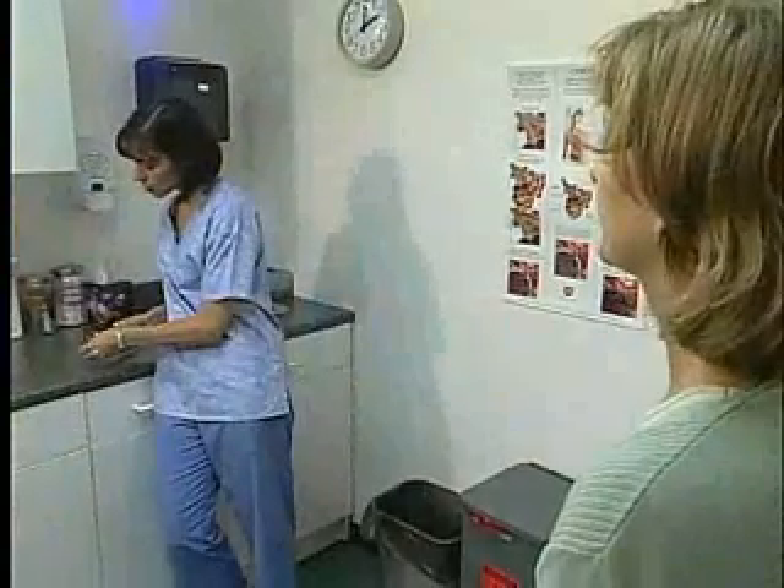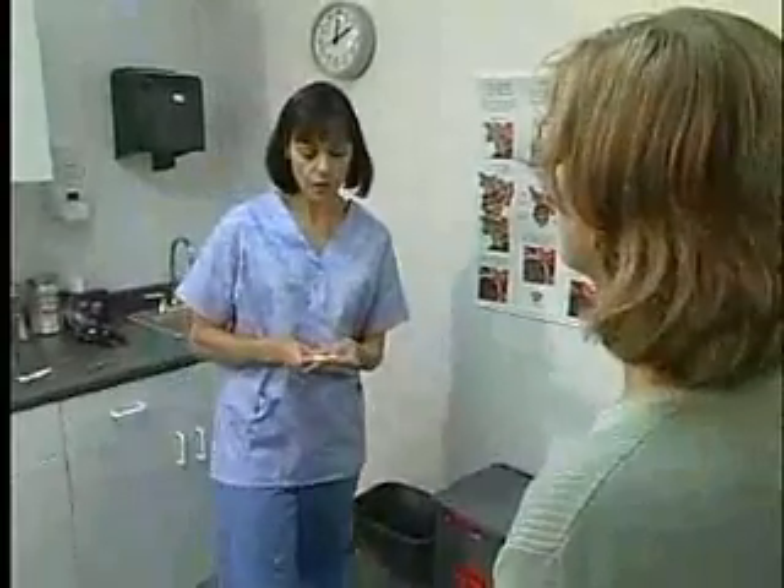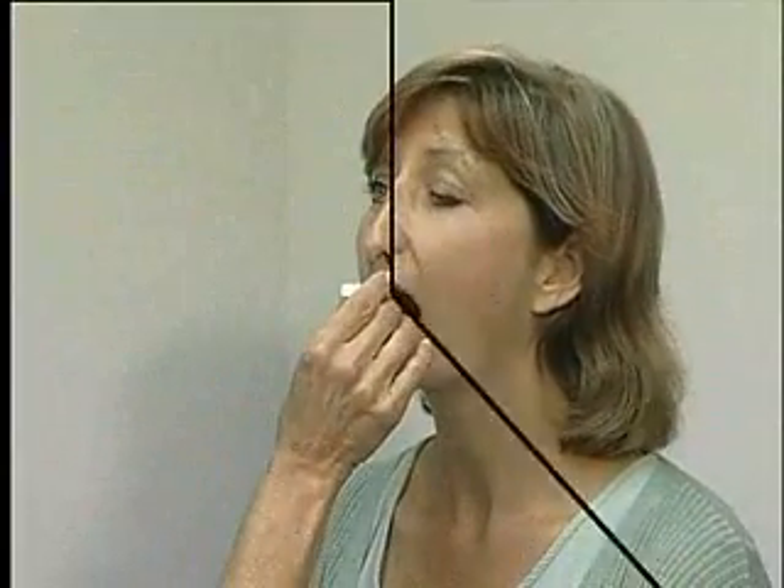I'm going to take your temperature. Do you smoke? No, why? Well, smoking can affect your temperature, and so can drinking fluids — but only if we were using an old-fashioned glass thermometer. But you're fine. Open up. Wow, that's fast. Technology — isn't it great?